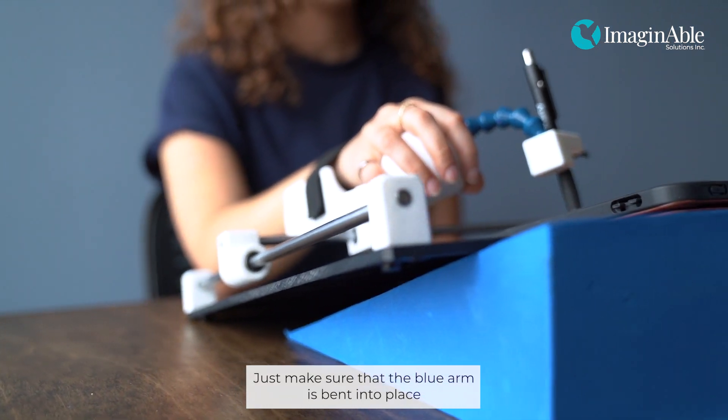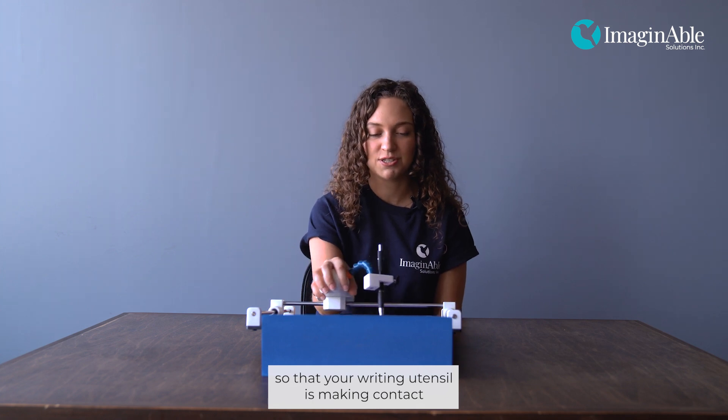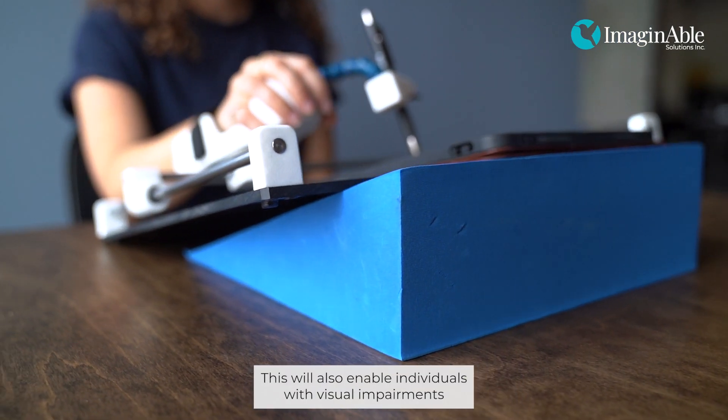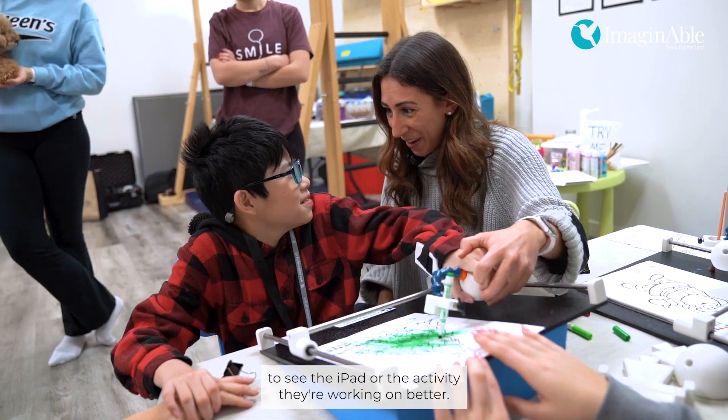Just make sure that the blue arm is bent into place so that your writing utensil is making contact with the iPad or the paper. This will also enable individuals with visual impairments to see the iPad or the activity they are working on better.